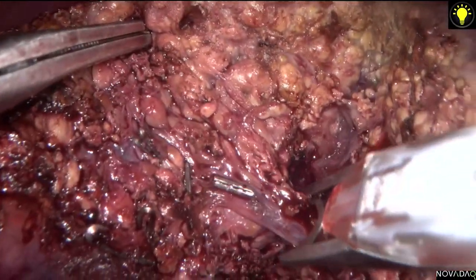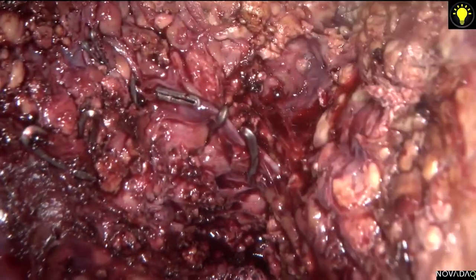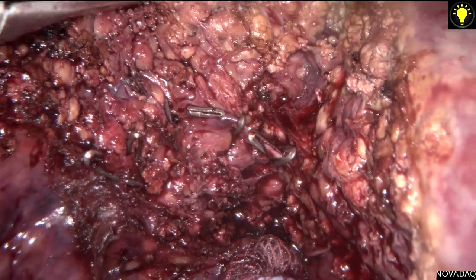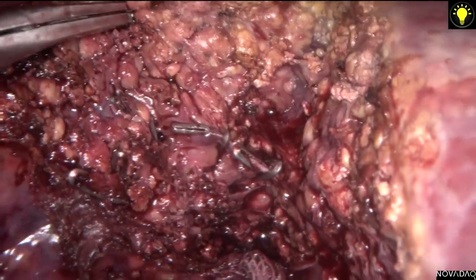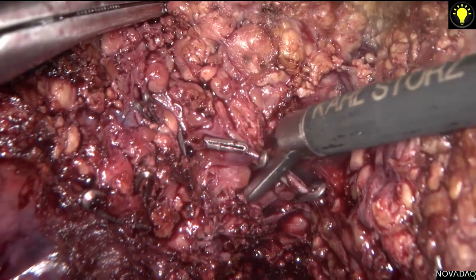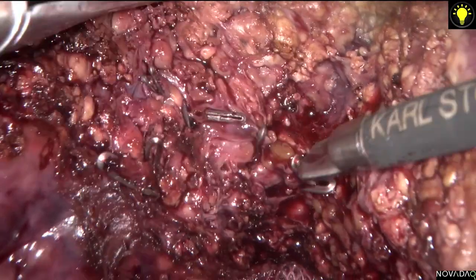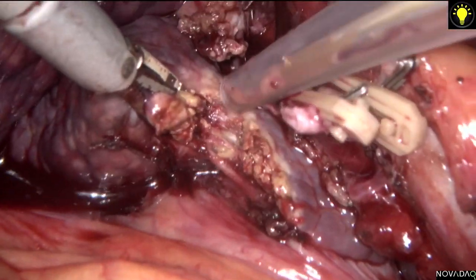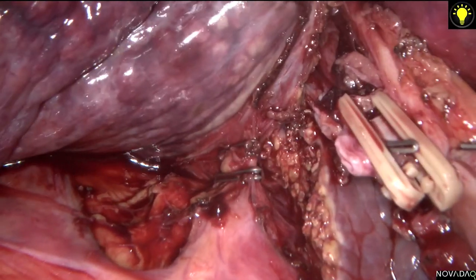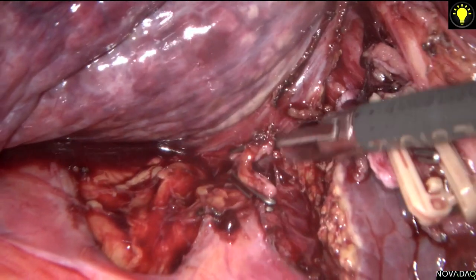the experience, and it may be difficult in patients with liver cirrhosis, where there may be a lot of regeneration nodules that prevent a very accurate assessment of the situation. The detection rate for small tumors by laparoscopic ultrasound is less than 40%. Although nowadays contrast CT scan provides very good imaging of the lesions inside the liver, it will still be good to have a sensitive real-time assessment of the tumor, which is easy to use with reliable outcome.